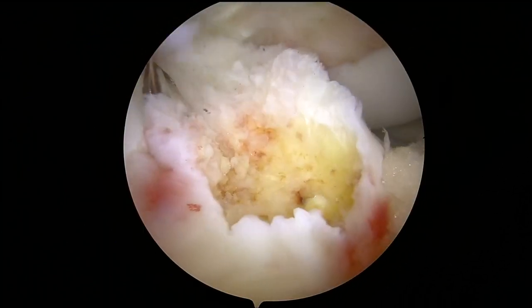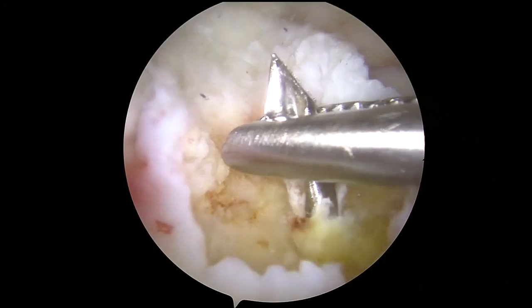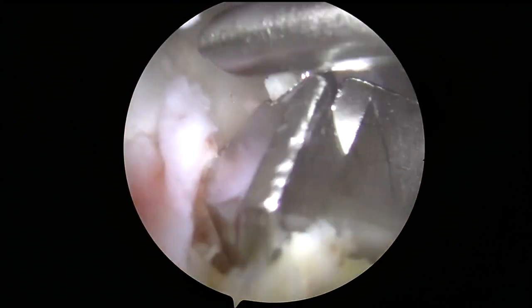The ACL tibial tunnel guide is used to drill a guide pin and then the guide pin is over-reamed with a 10 millimeter reamer. The tunnel is cleared out and a passing stitch is placed.